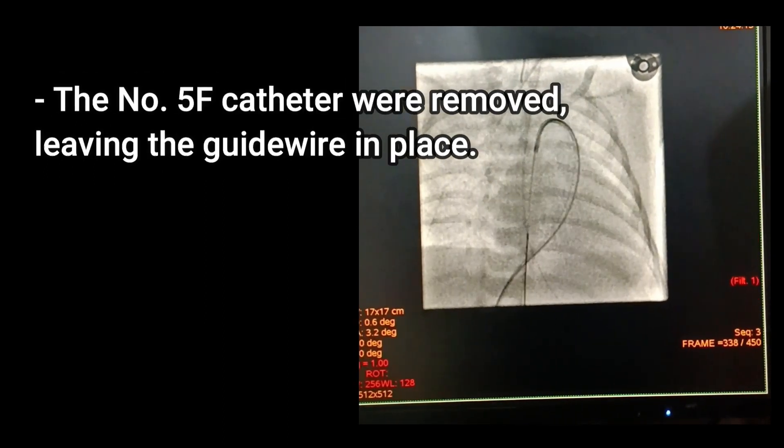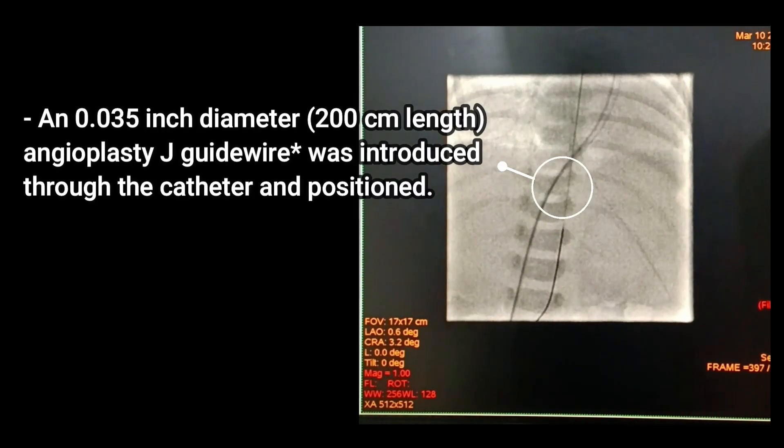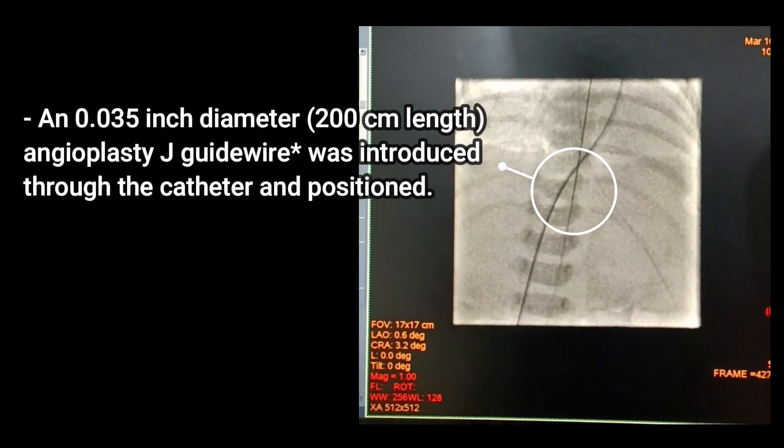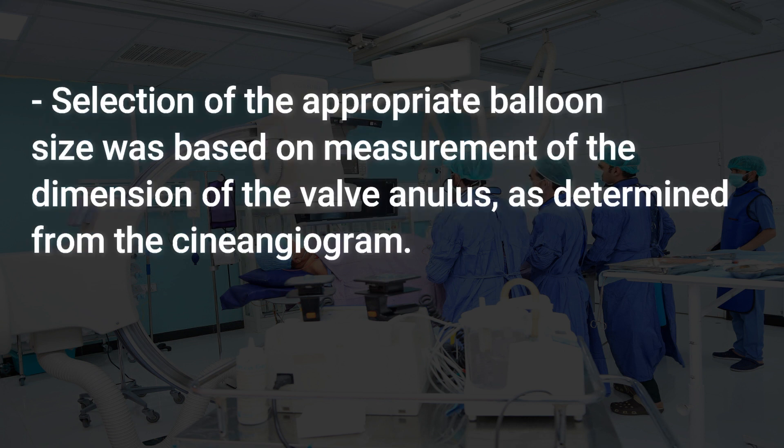The number 5F catheter was removed, leaving the guidewire in place. A 0.035-inch diameter, 200-centimeter length angioplasty J-guidewire was introduced through the catheter and positioned. Selection of the appropriate balloon size was then based on measurement of the valve annulus dimension.